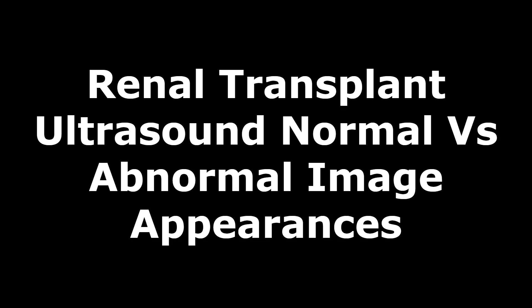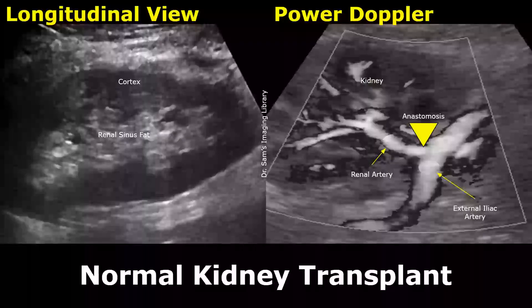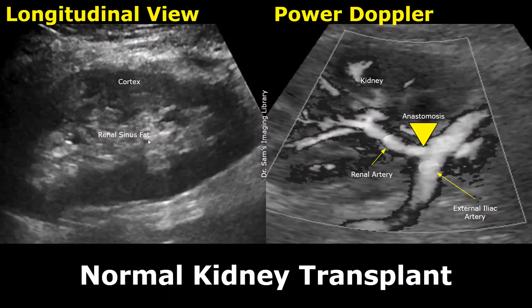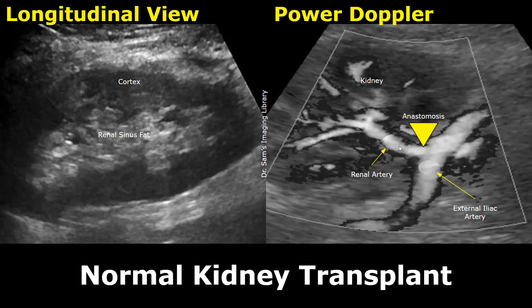Hello everyone, this is Dr. Sam and this video is about renal transplant ultrasound. These are images showing a normal kidney transplant. This is a longitudinal view. This is the outer cortex and we can see the hyperechoic renal sinus fat. Over here is a power Doppler image showing blood flow in the renal artery, and we can see the anastomosis with the external iliac artery, showing normal blood flow in this renal transplant.